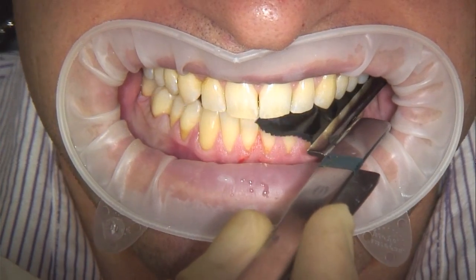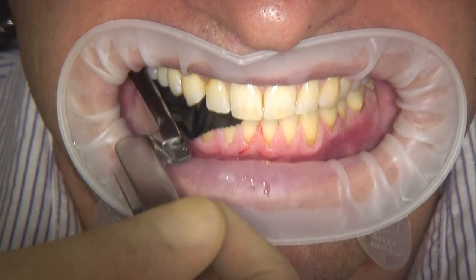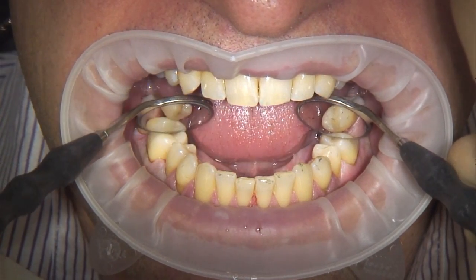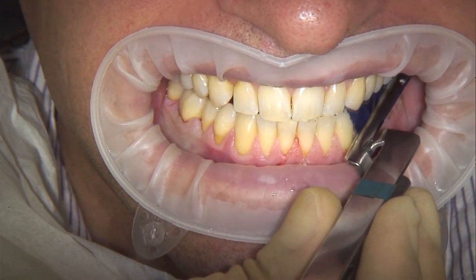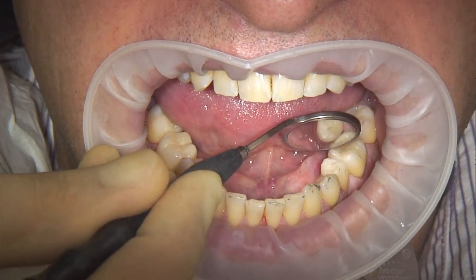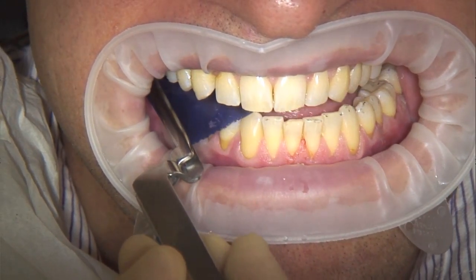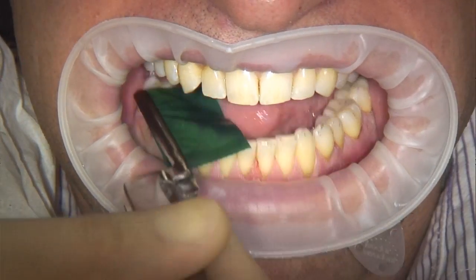Bausch occlusion test films meet all these requirements and are characterised by colour-intense marking, especially on occlusal surfaces which are hard to test. Bausch Artifol occlusion films are especially suitable for representing static and dynamic occlusion in several colours. Artifol occlusion films — ultra-thin, 8 micron, one-sided — are available in 5 different colours, as well as double-sided in 4 colours.